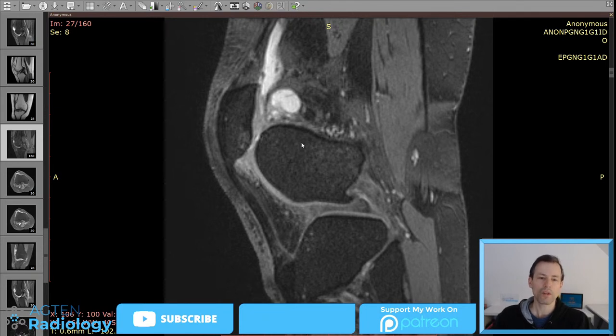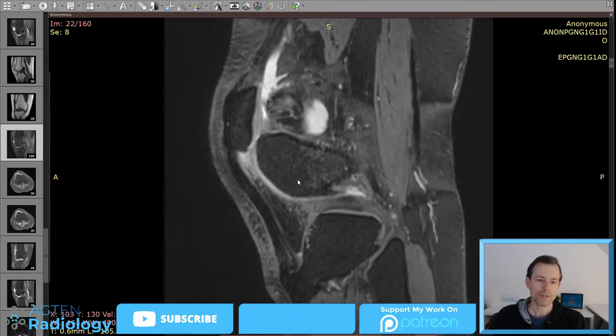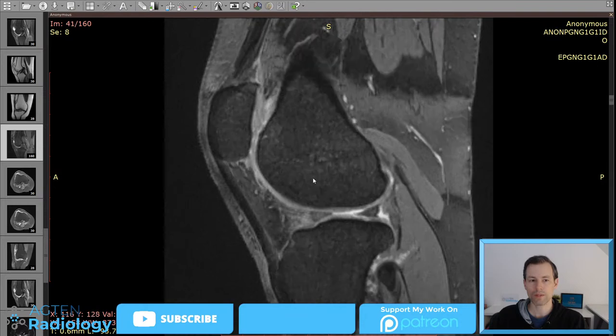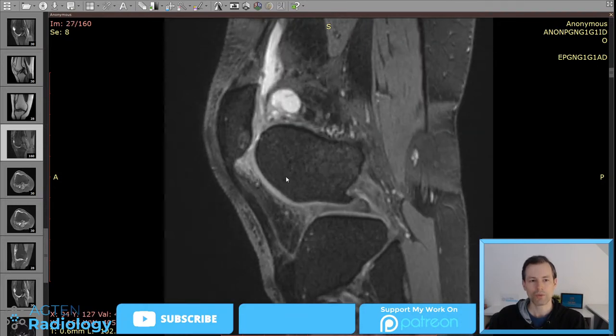But, and I think it's important, if you have, let's say, a large ganglion cyst or a large cystic appearing lesion near a joint, ankle, for example, it's sometimes better to give gadolinium to really make sure it's just a very subtle rim enhancement, because the worst case would be a synovial sarcoma, which could look very cystic on MRI, which is actually not good if the patient comes for a mass and you just say it's a ganglion cyst and it's actually a synovial sarcoma. So I've seen cases where this actually happened, where the initial report said, okay, it's a ganglion cyst, but then you give gadolinium and it's completely enhancing, right? So this is kind of a little bit more tricky.